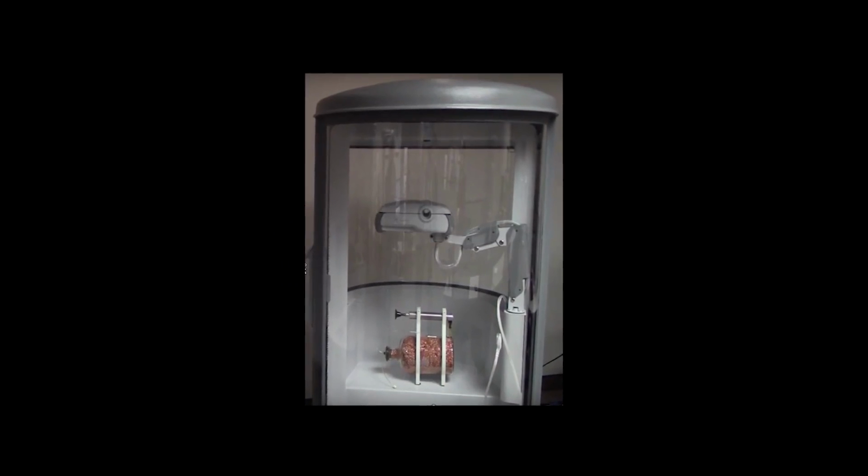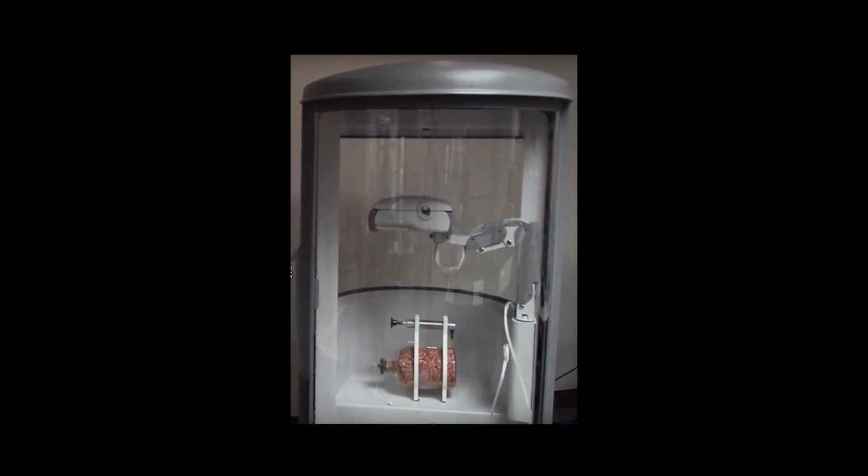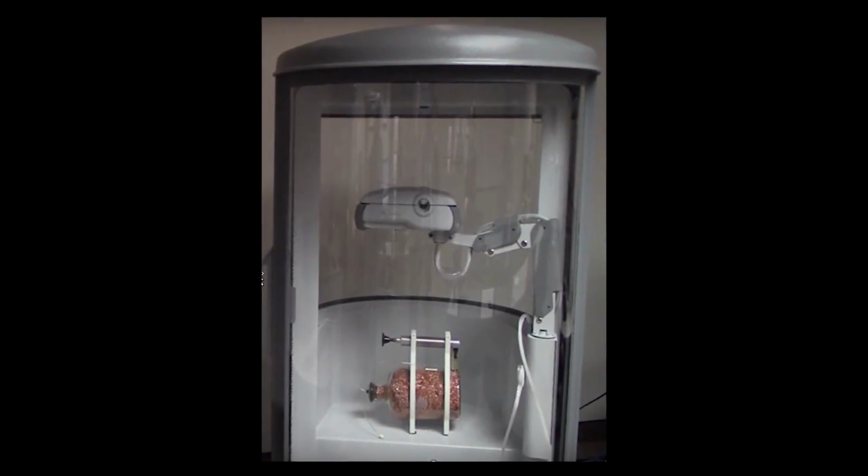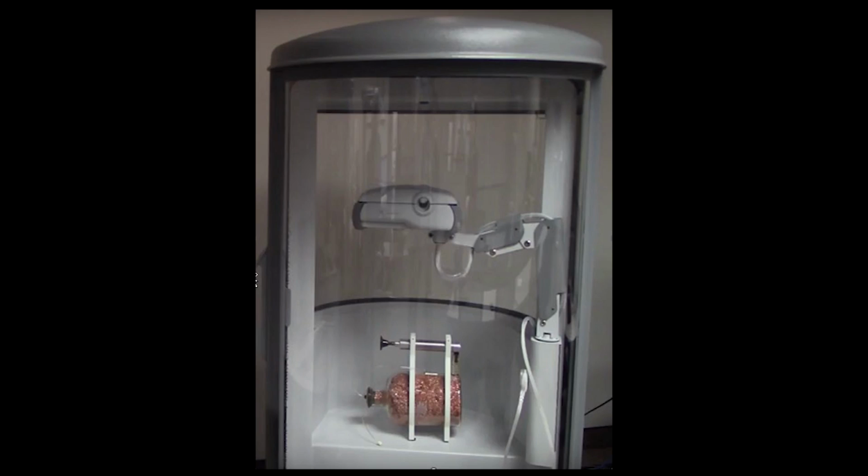While a 3-liter syringe cannot be used for measuring lung volumes via plethysmography in the Platinum Elite, an isothermal bottle from MGC with a known value can be used in its place. Please refer to our YouTube channel to see a video on performing isothermal bottle testing.